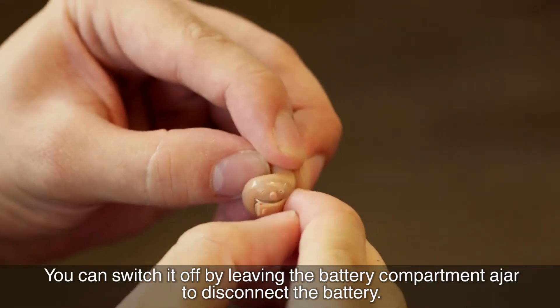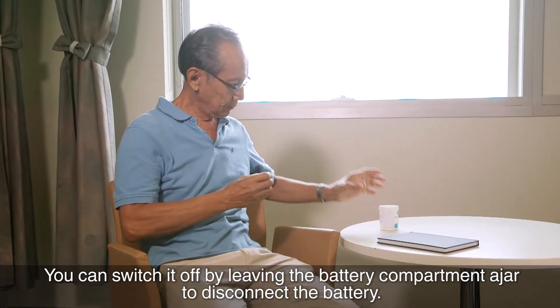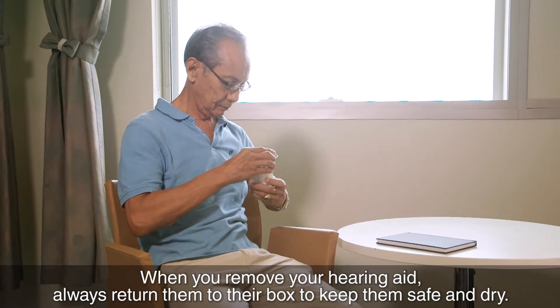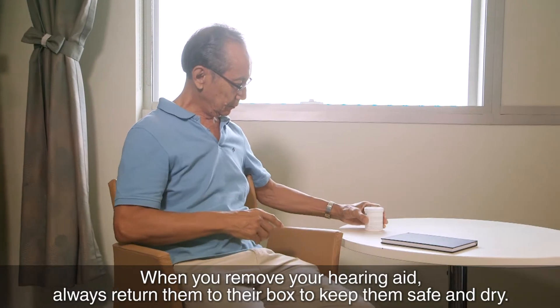You can switch it off by leaving the battery compartment ajar to disconnect the battery. When you remove your hearing aid, always return them to their box to keep them safe and dry.